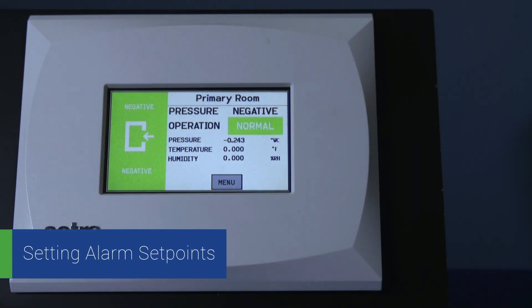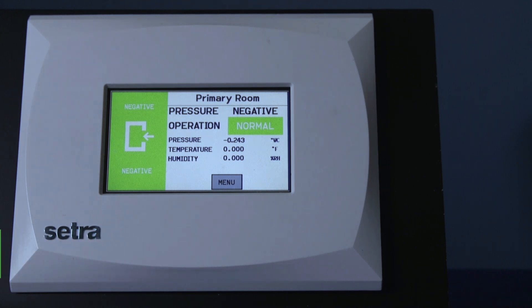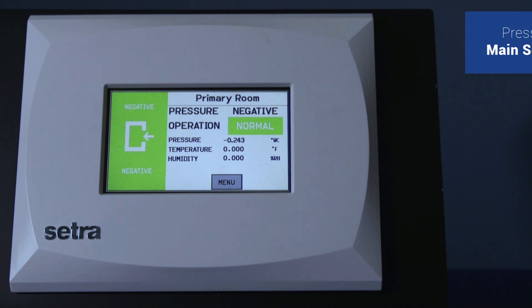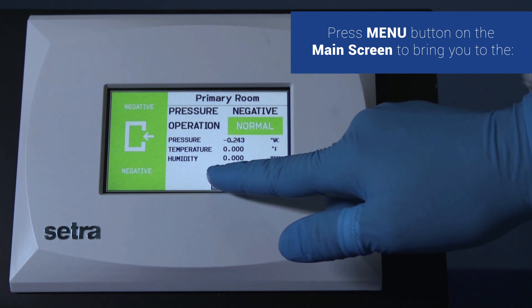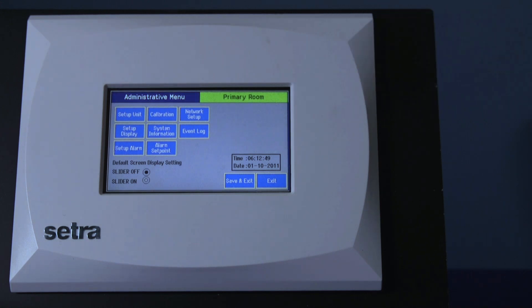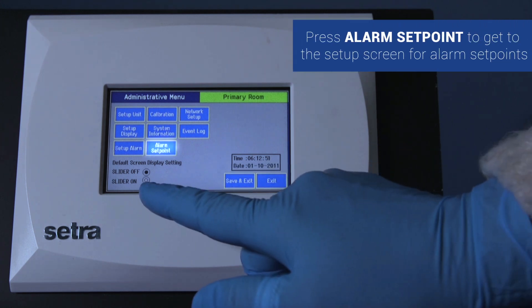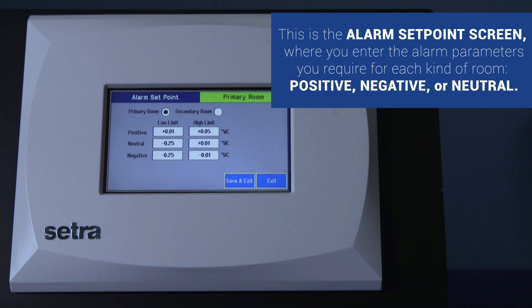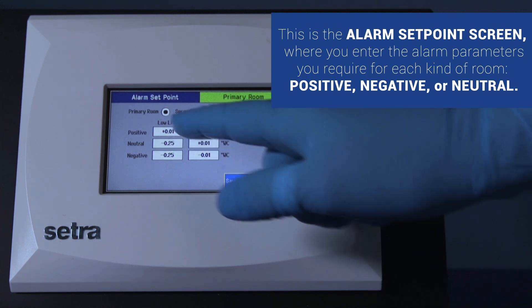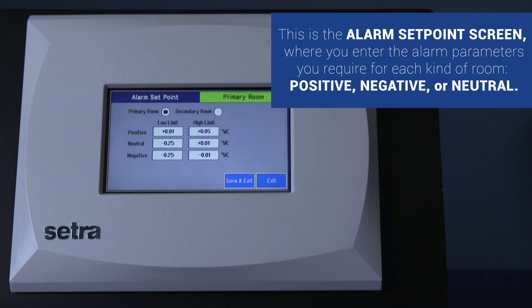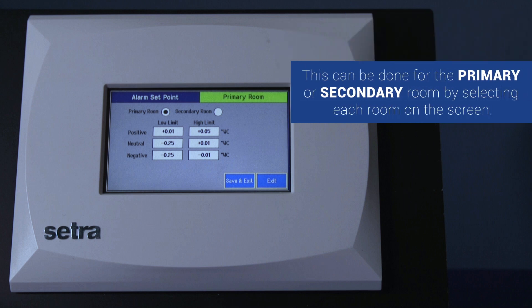Setting alarm set points. This is the main screen. Press menu to get to the administrative menu screen. This is the administrative menu. Press alarm set point to get to the setup screen for the alarm set points. This is the alarm set point screen where you enter the alarm parameters you require for each kind of pressure — positive, neutral, and negative rooms. This can be done for the primary room and the secondary room by selecting each room on the screen.